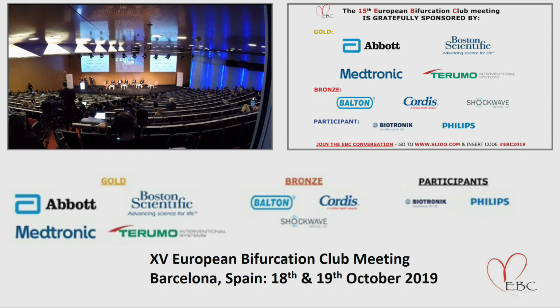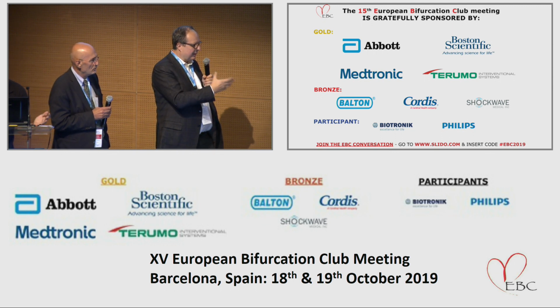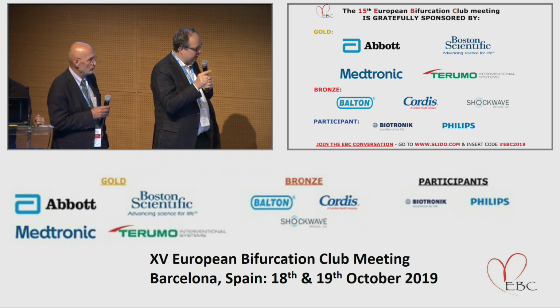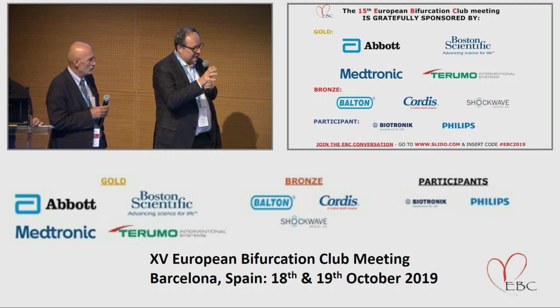So Shaoliang has done model testing that he's published that showed that, but I have personal experience of having that happen to me. The first description we did of the modified balloon crush was like the DK crush except without the first kiss. Shaoliang wrote a letter into CCI.